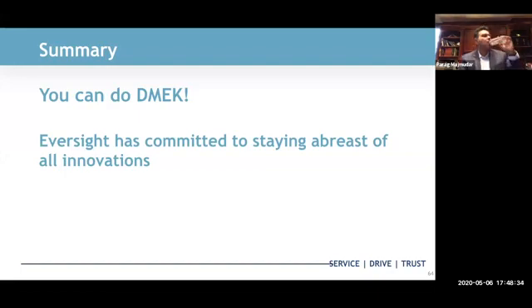Okay, next question is, any special considerations if doing DMEK in conjunction with phaco? That's a great question. There are a few things. I have always found that doing them separate, if possible, gives you better results. And for whatever reason, it's not a big difference, but I just like to do them separate if I can. Now, sometimes you can't. Sometimes you have a patient with advanced Fuchs, and they're going to need a graft, and then I'll do them at the same time.